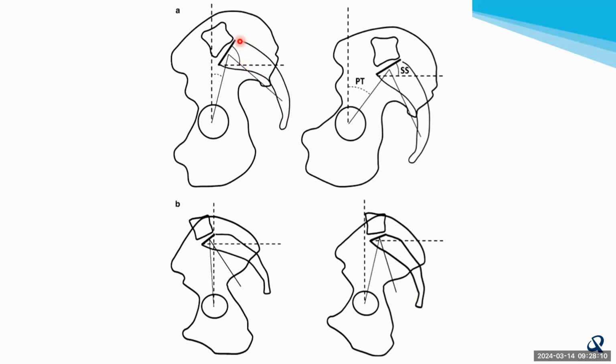It is the sacral slope, relative to horizontal. You can see the superior end plate of the sacrum here, and the sacral slope is just this angle that the superior sacral end plate makes with horizontal. You can see it's bigger here and smaller over here, but pretty straightforward. Okay. So sacral slope, that's angle number one.